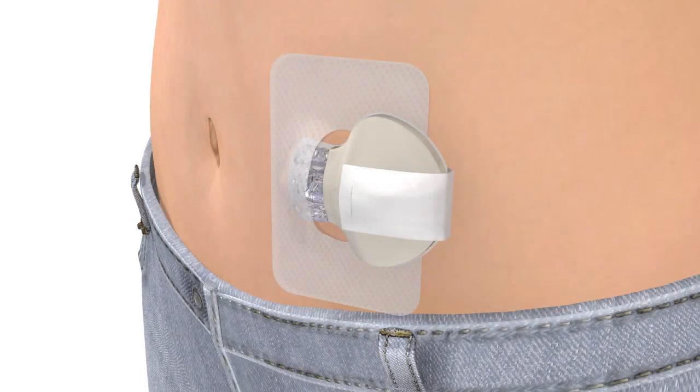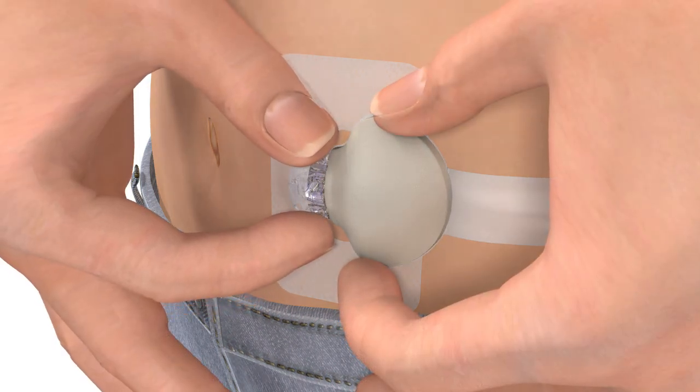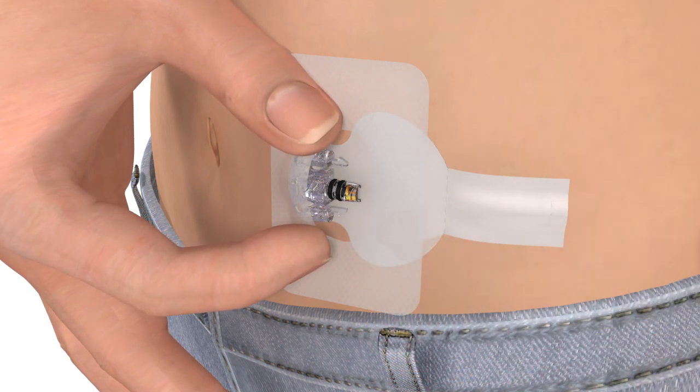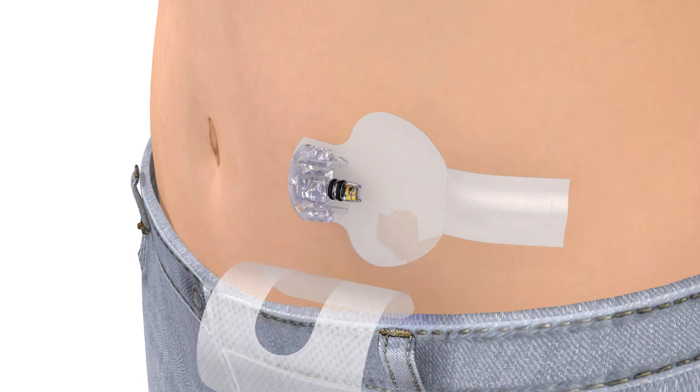Before you insert a new sensor, you will need to remove your old sensor. Peel the adhesive tab off the transmitter. Disconnect the transmitter by pinching the flexible arms of the sensor with one hand and pulling the transmitter away with the other. Now, peel off the transparent sensor overtape.